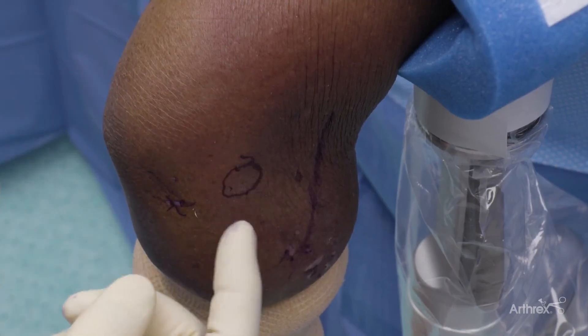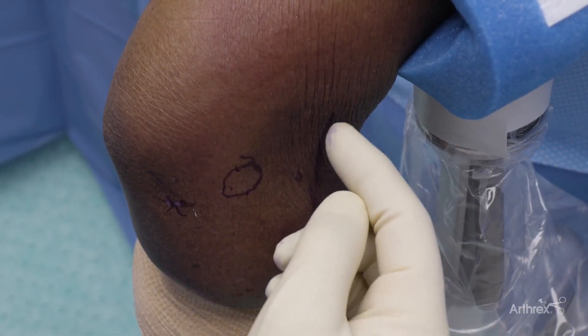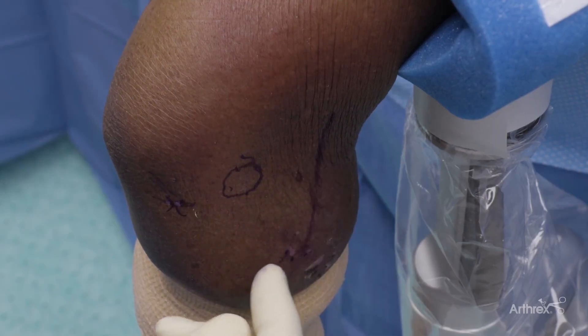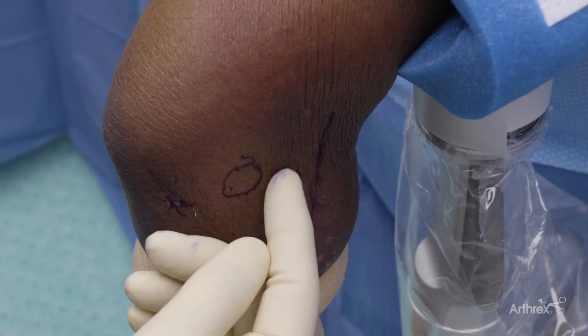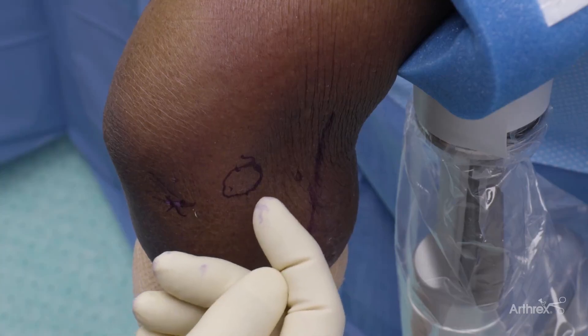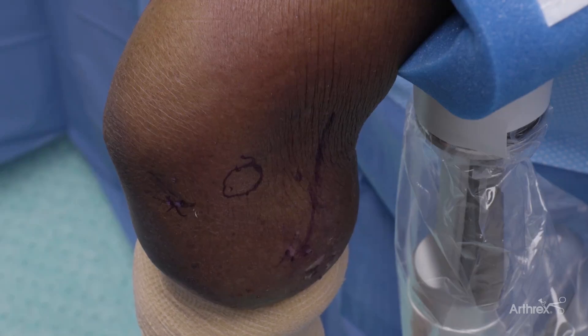This is the lateral epicondyle. One of the things we are concerned about on the radial side is the radial nerve. There are three portals that are always discussed. The more distal you go, the more dangerous it becomes regarding the radial nerve. So what you want to do is try to be more proximal with your cannula placement. Usually I use the mid lateral portal, which allows for safety and excellent viewing of the area.